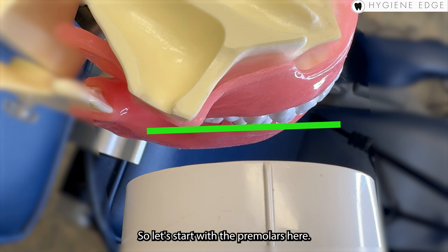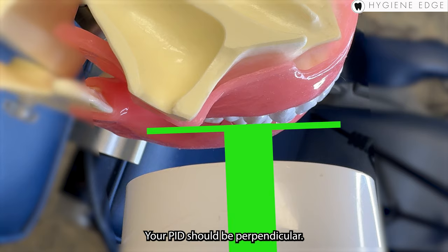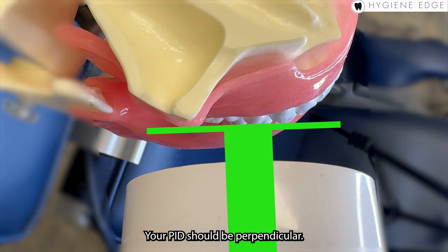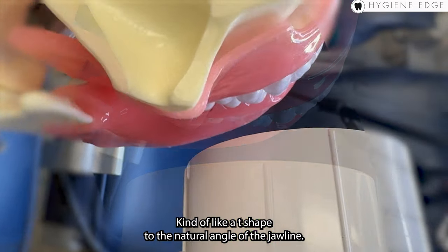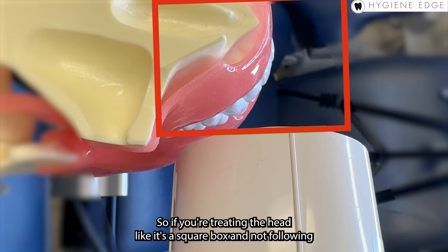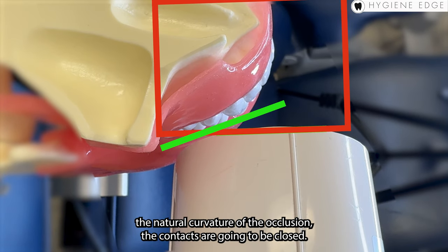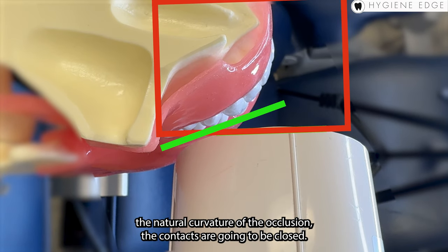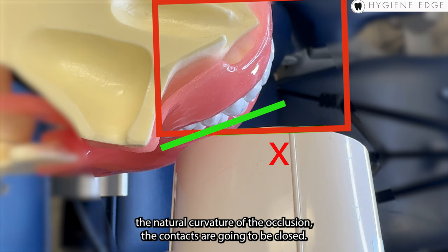So let's start with the premolars here. Your PID should be perpendicular, kind of like a T shape, to the natural angle of the jawline. So if you're treating the head like it's a square box and not following the natural curvature of the occlusion, the contacts are going to be closed.